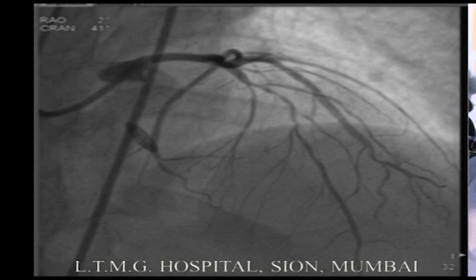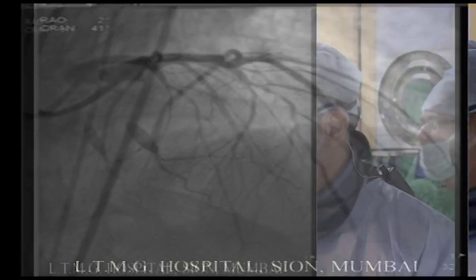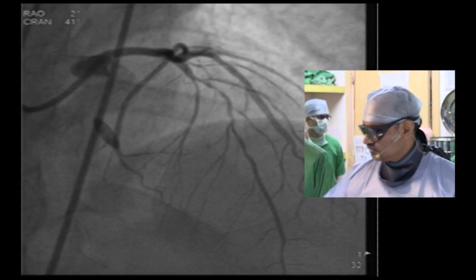So this is one problem. What stent should I use, and how to put a stent for this region? This is one problem, I think.